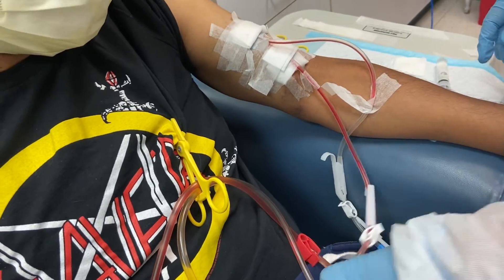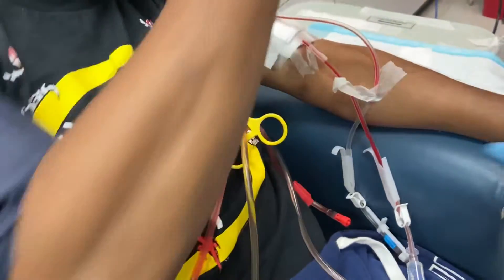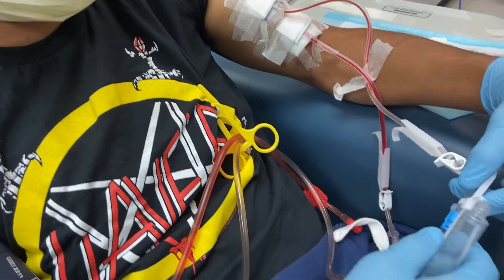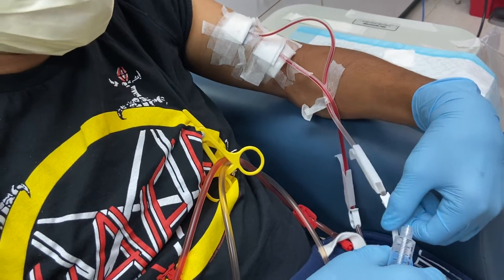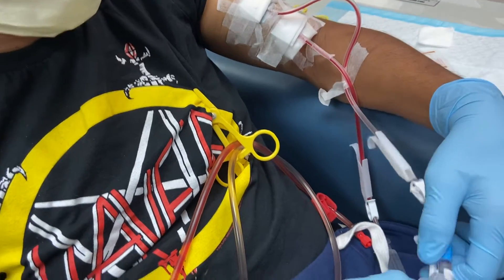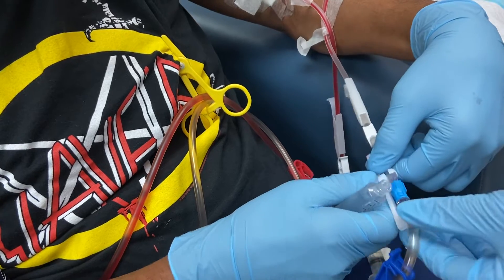Disconnect the venous. Take the clips out. Push out. You need to touch the venous — this part first. Just push down, like this part here.